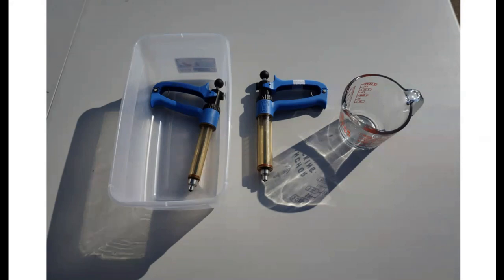So when we're mixing vaccine, let's say we were using a product like Shield, which is a modified live vaccine that we have to mix. It's going to have a glass bottle and a plastic bottle. I'm going to take the transfer needle and put it in the plastic bottle, turn it upside down, and put the other end of the transfer needle in the glass bottle. The glass bottle will have a vacuum in it. That vacuum will pull my liquid across. I'll pull the needle and the plastic bottle off and gently swirl that vaccine around. After I pull that vaccine up in my syringe and that glass bottle is empty, I'll stick that transfer needle back in it. So when I'm not using the transfer needle, on one end, it's going to have the glass bottle. On the other end, it's going to have the plastic bottle. That just keeps my transfer needle clean as I'm working cattle throughout the day. And then I can pull it apart when I get ready to mix that next round of vaccine. So that's how I would keep that transfer needle clean while I'm working cattle.